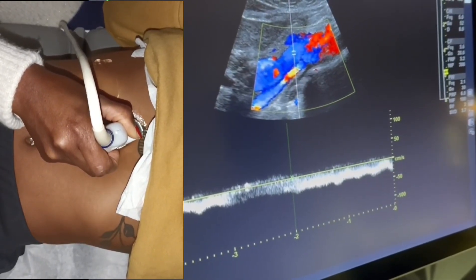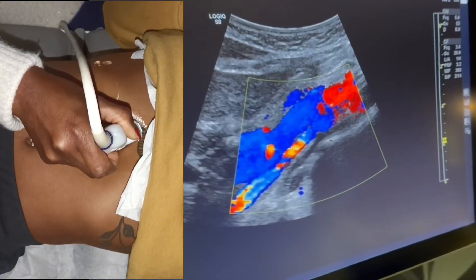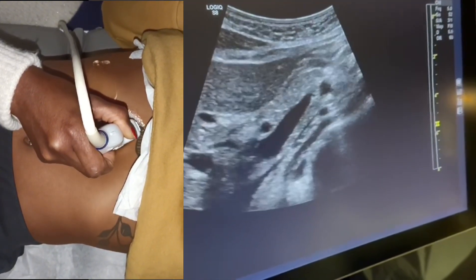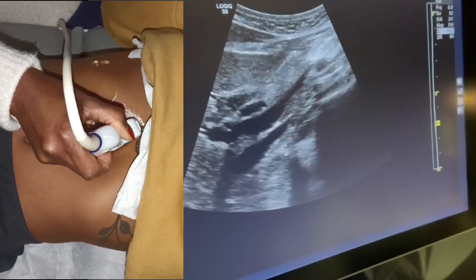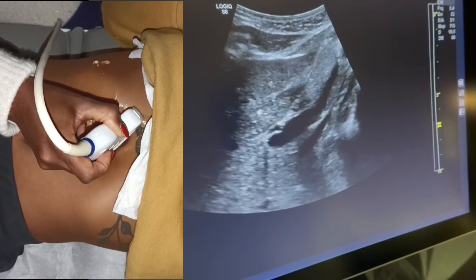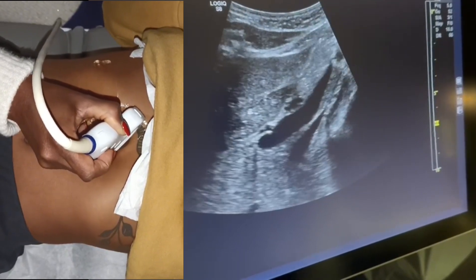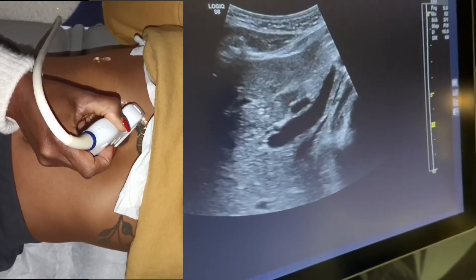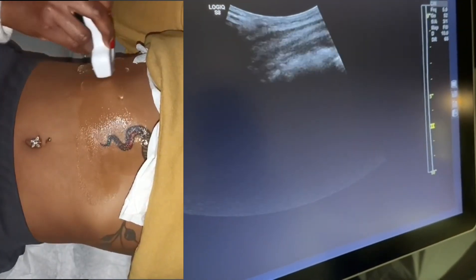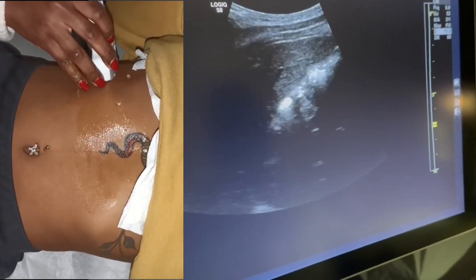You're going to freeze that, measure it, and always put an angle on it. Taking color off, I'm now going to follow that portal vein into the liver. In order to get a positive Doppler shift and hepatopetal flow, I like to use an intercostal approach — going in between the ribs.